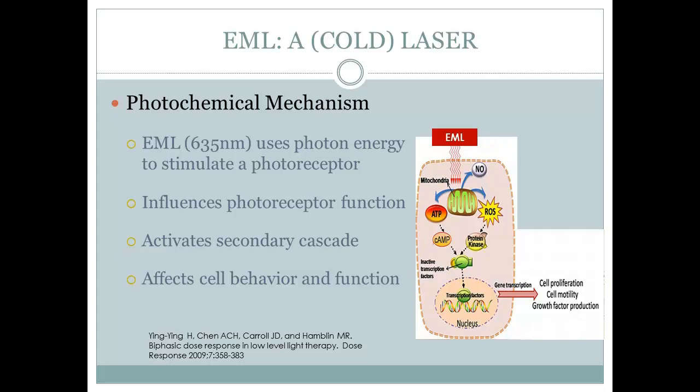And ATP is a very important biological catalyst in the cell, activating a plethora of biochemical reactions within the cell. Additionally, by increasing ATP, there's also an increase in reactive oxygen species, or ROS. And this is, as depicted here, the image that's going to activate as well specific biochemical reactions. So we see here, by stimulating a single receptor with laser, we're able to initiate what is known as a secondary cascade or signal transduction pathway. This in turn is going to activate enzymes, ultimately affecting the way genes are expressed, the way proteins are synthesized, and overall modulating cell function and behavior.